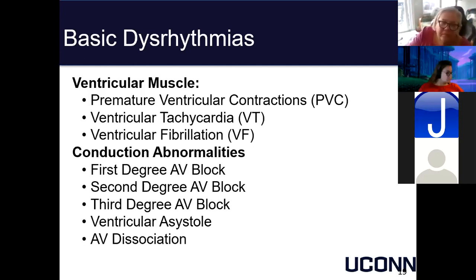Just for clarification, when you talk about PEA and asystole, in the case of asystole, it's the ventricular asystole. There's no such thing as atrial asystole. I do think atrial fibrillation is almost as close as you come, but there again, you're right. There is atrial conduction, even in atrial fibrillation. You will sometimes see an SA node doing its thing. You'll see P waves across an EKG with no ventricular response. That's still considered ventricular asystole, though. Okay.